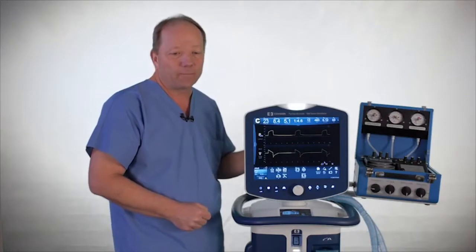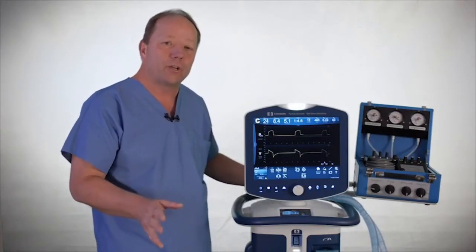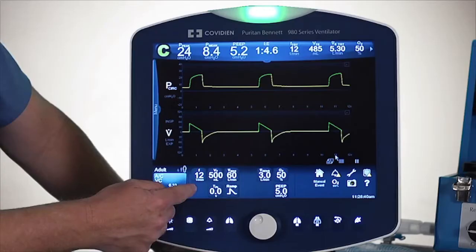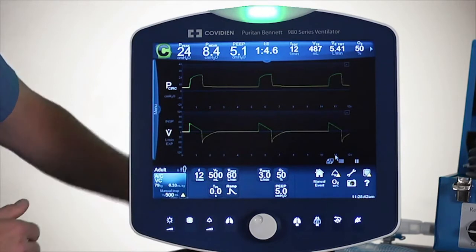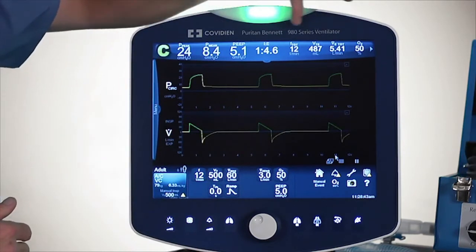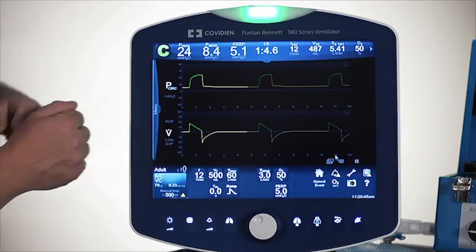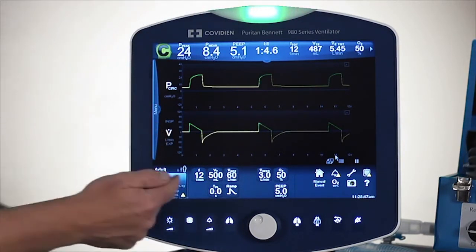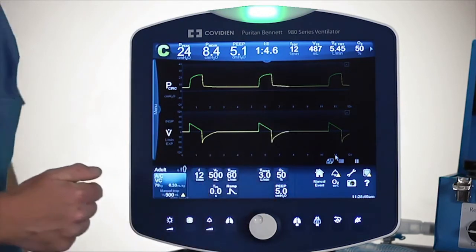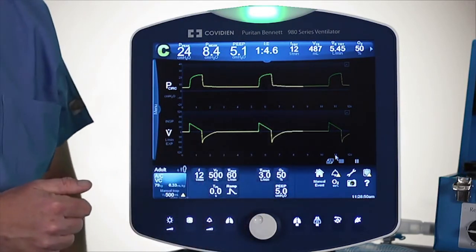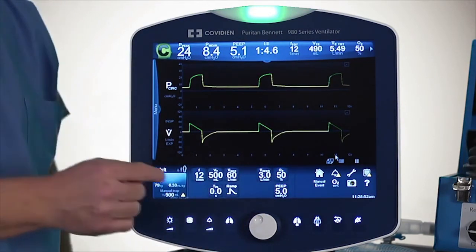Now that we have the ventilation going, I want to show you how simple it is to change a setting. The way the screen is laid out, we've got the patient data information on the top, the graphs in the middle, and on the bottom is your primary settings area. I'm going to show you how to make a simple change with the rate.